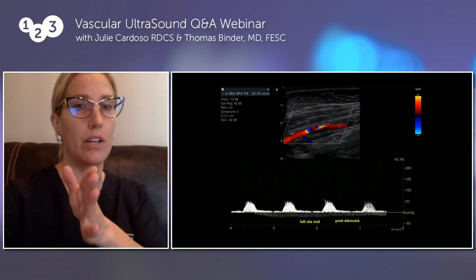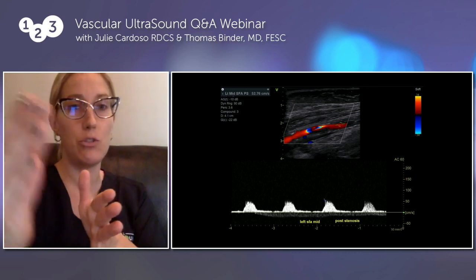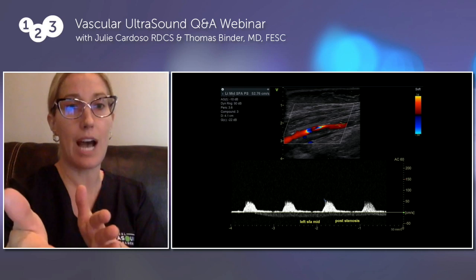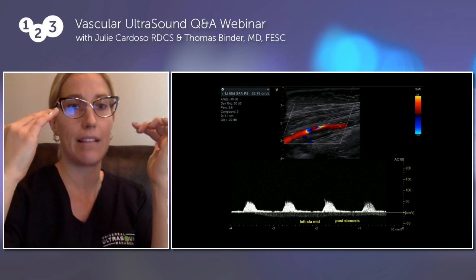So this would be a good indication. Say, for instance, you put your transducer down and you saw this waveform with your Doppler, you automatically want to think, okay, proximal to where I'm insonating, there has to be an obstruction, because my flow in this particular section is dampened and monophasic. So you want to be a good investigator and find out where the stenosis is and what the percentage is. Okay, I guess this was a lecture in its own, and I think a very, very precise demonstration of how we can quantify stenosis and lesions.